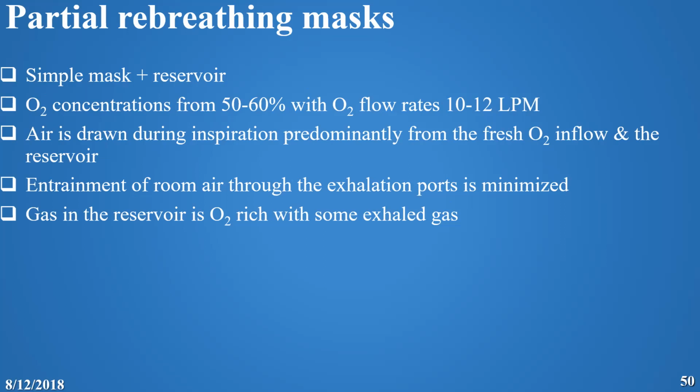Because the flow is high and there is a reservoir, the oxygen delivered to the patient is taken predominantly from the fresh oxygen coming in and from the reservoir. The room air through the exhalation ports is a very small amount.